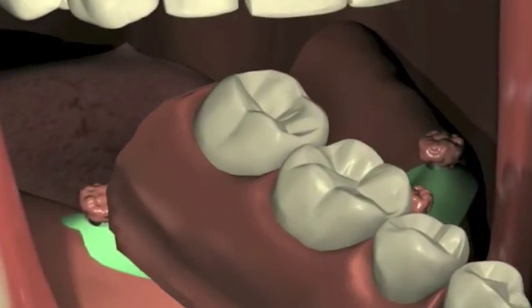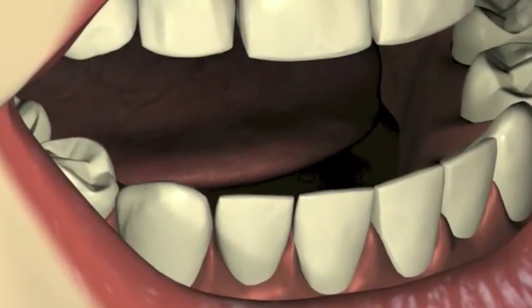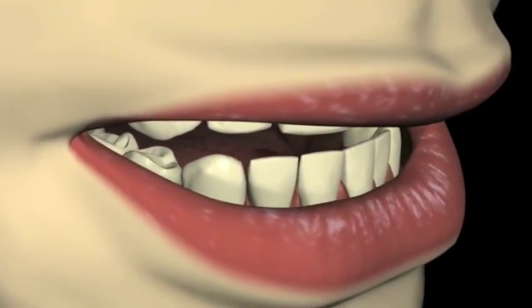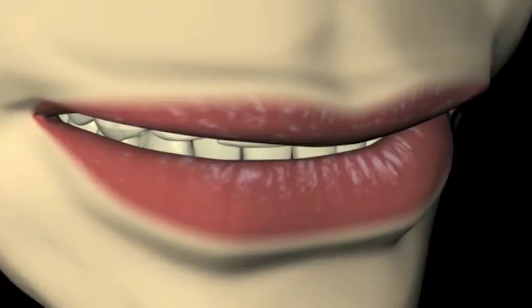As soon as the acrylic in the denture becomes resistant to flow, seat the denture, keeping light bilateral pressure on the occlusal surface. Have the patient close gently into maximum intercuspation.